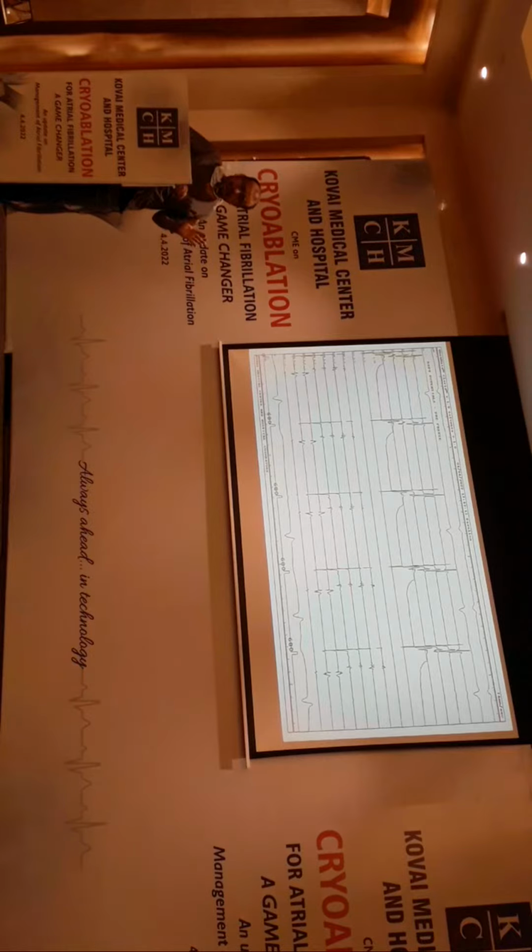This phrenic nerve injury is also common with radiofrequency ablation. The advantage here is, what we have seen from a large data of cryoablation, most of the time it's reversible. Even though you have caused a phrenic nerve injury, it is reversible in most of the patients. Permanent phrenic nerve injury is very, very uncommon, very rare.